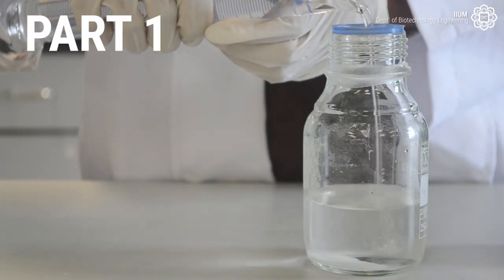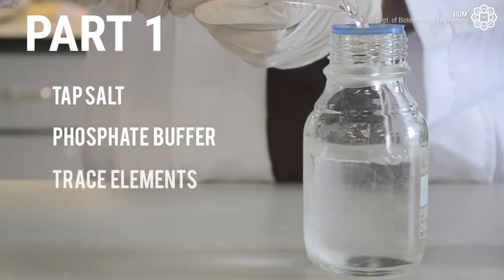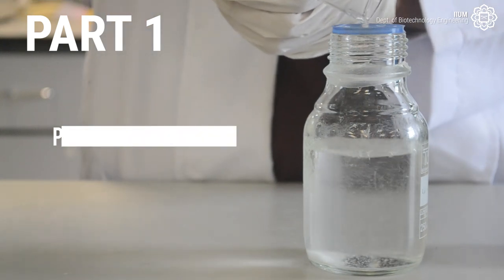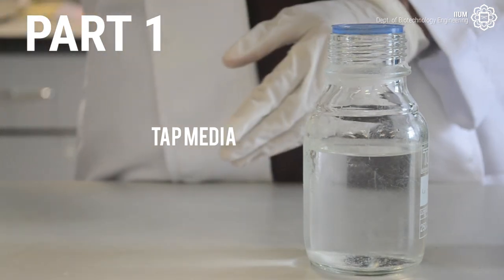In this video, we will show you how the tap salt, phosphate buffer, and trace elements are made. All these components are the composition in the TAP media which is used to grow the microalgae.